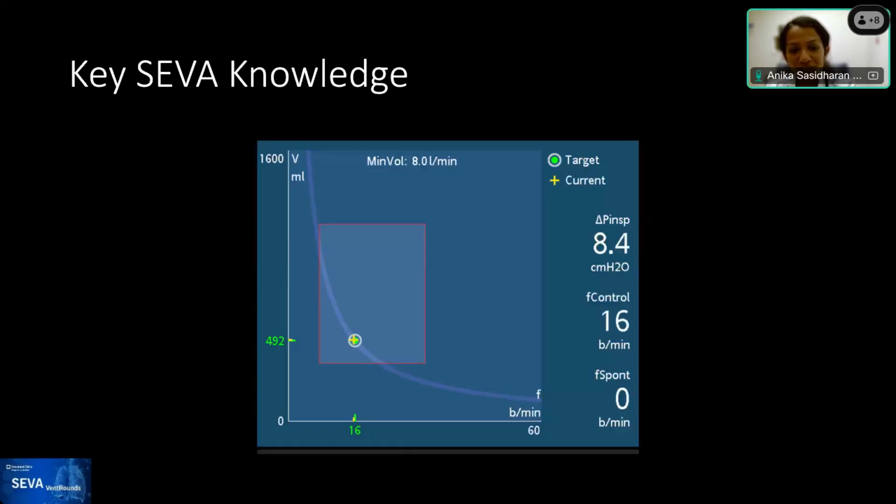All right, so we can just get started. Over here, we are just going to go over some basics of ASV ventilation, which we commonly find on the Hamilton. So we'll just talk about some basics on this slide, and then we'll go into a specific waveform and troubleshooting a particular problem. Can you see my cursor, Rob? Yes. Okay.